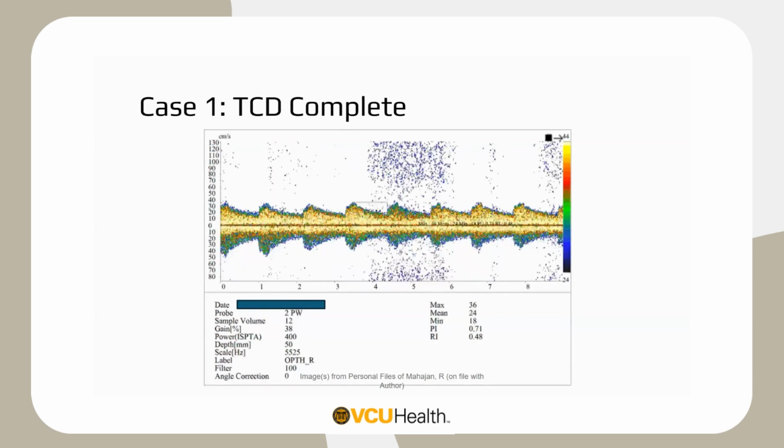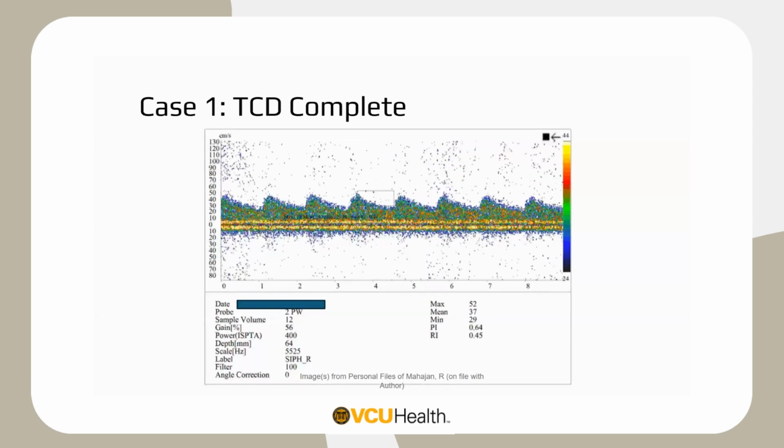On the right side, we see a very different story. The right ophthalmic artery, we have a low resistance waveform, and the flow is away from the probe in the orbital window. So we have reversed flow in the ophthalmic artery, now showing characteristics of low resistance waveform consistent with reversed ophthalmic flow and internalization of the ophthalmic flow. The siphon on the right side, so if we increase the depth on the right, the velocity is low, sorry, so similar to what we've been seeing on the right side. So ICA velocity is low, but not terrible. And otherwise, the direction is normal and the PI is normal.